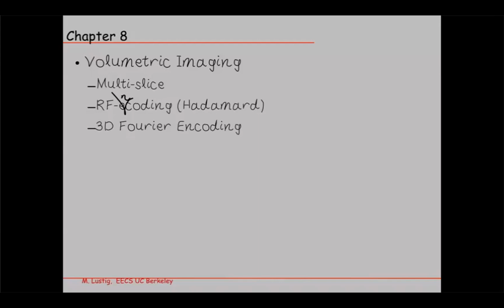The lab is about pretty much imaging. You're going to prescribe sequences on a clinical scanner. You see the user interface. You'll set parameters, change field of view, resolution, TR, bandwidth. Look at the noise, and what happens when you change the resolution. How you can gain back the noise by averaging, or all sorts of other tricks. And then also look at contrast. And at the end, you're going to eliminate a tissue with inversion recovery.